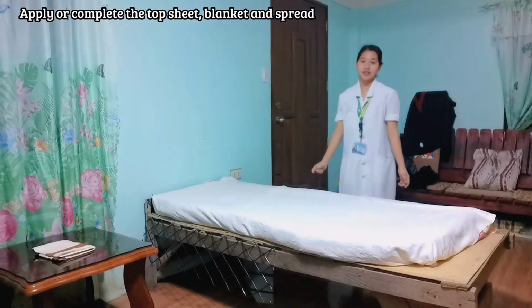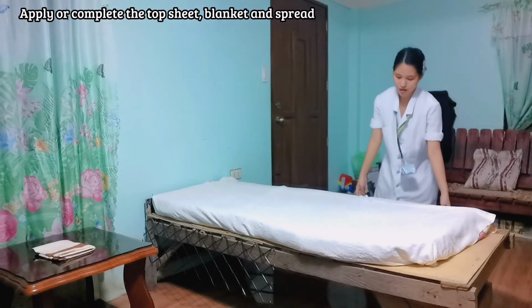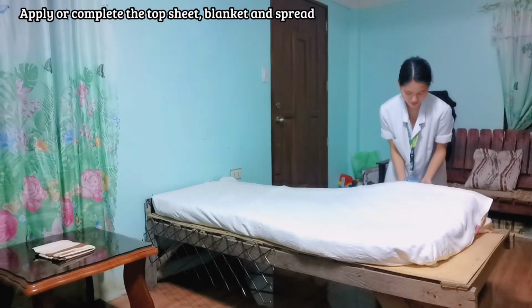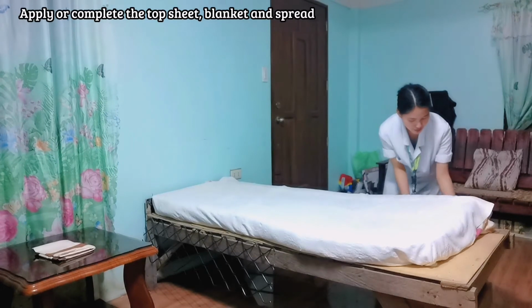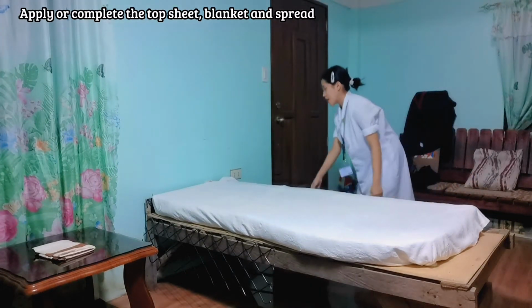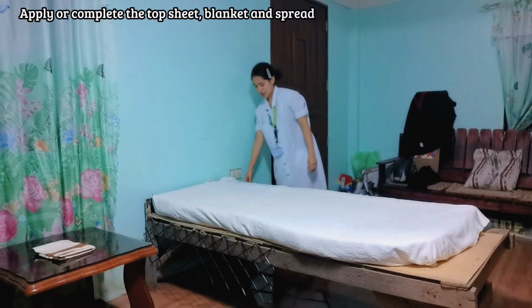And then after that, tuck in under the mattress. And then also miter the top edge.